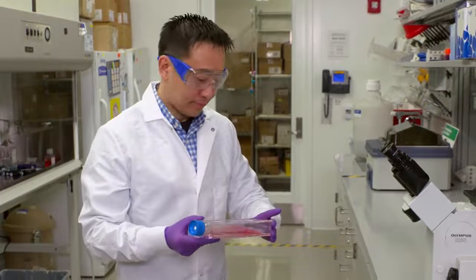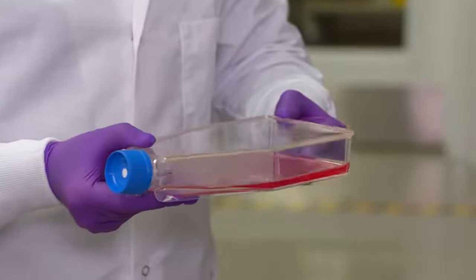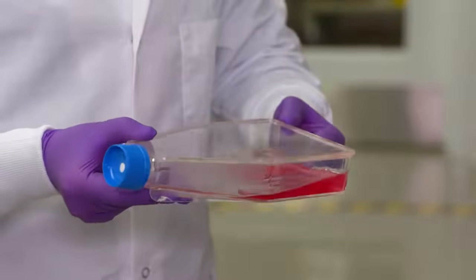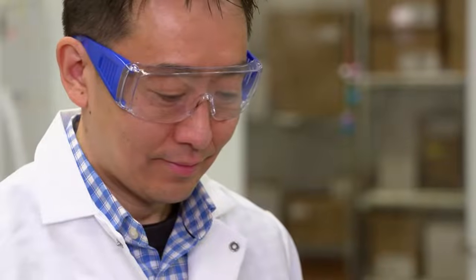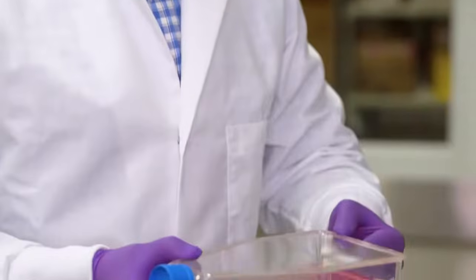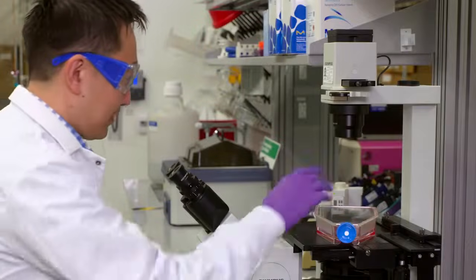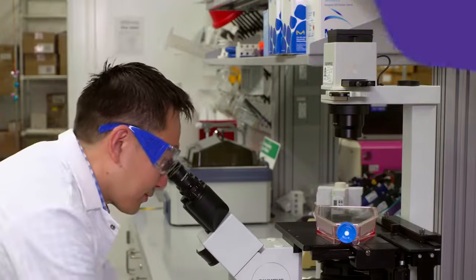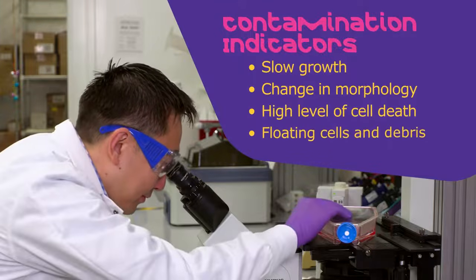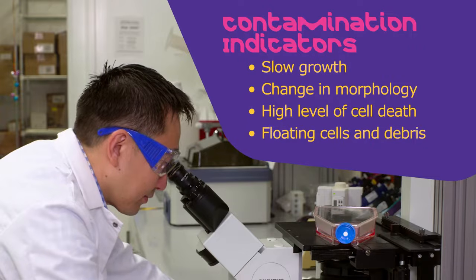Gross contamination can be easily checked by looking at the flask. Media should not appear turbid or cloudy. In addition, media should not exhibit rapid color change to yellow, which would indicate presence of rapidly growing bacterial contamination. Additional signs of contamination can be checked under a microscope as well. These include slow growth, change in morphology, unusually high level of cell deaths, and floating cells and debris.